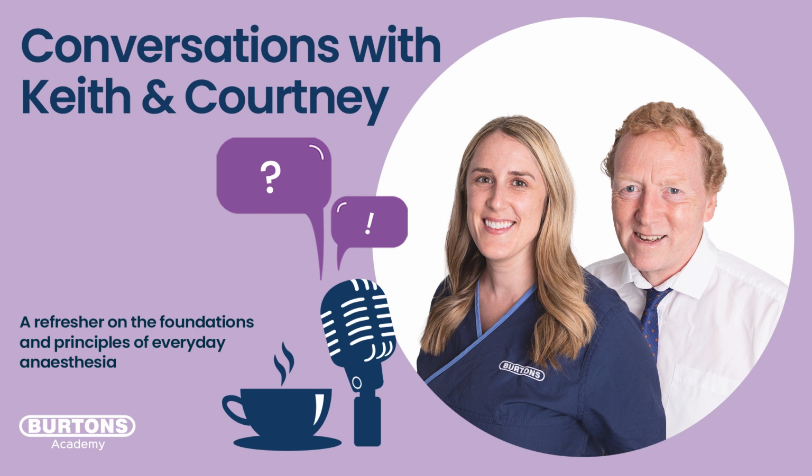So compliance has two components in as much as there's the natural compliance of the patient, and then there's things we do to it which change the compliance. And that's as important, and to some extent maybe more important. So if you take your patient with its nice compliant chest and you put it upside down and you wedge it into a cradle and you put the sandbags down the side and you've got it all nice and snug so that the orthopedic surgeon can do whatever they want to do in comfort and without the animal rolling around, it's great, but you may have severely reduced the compliance of your patient.